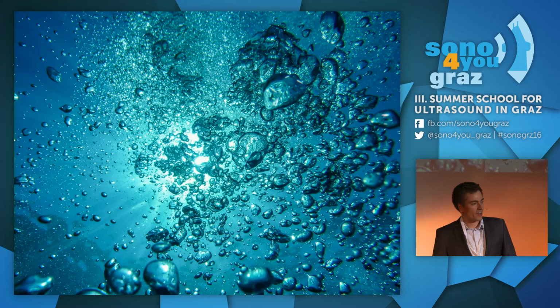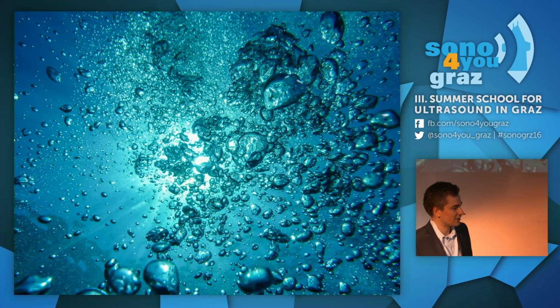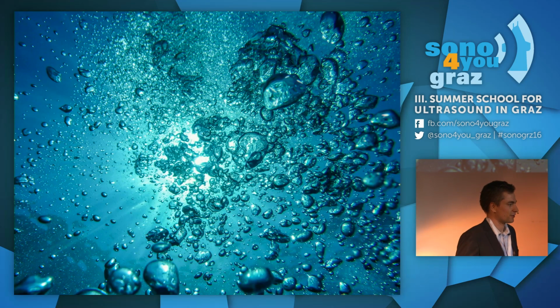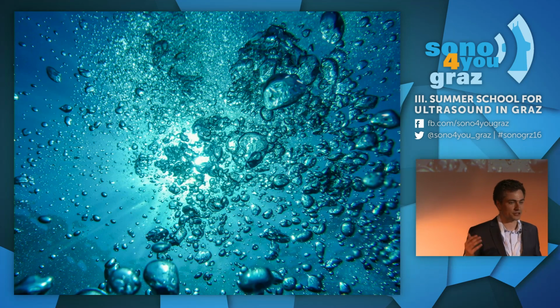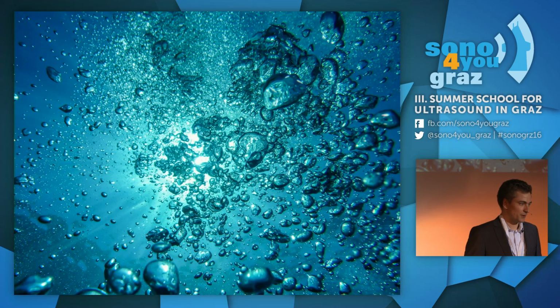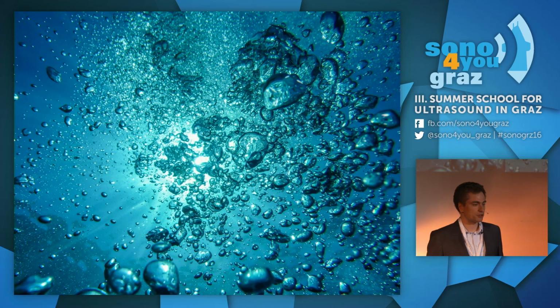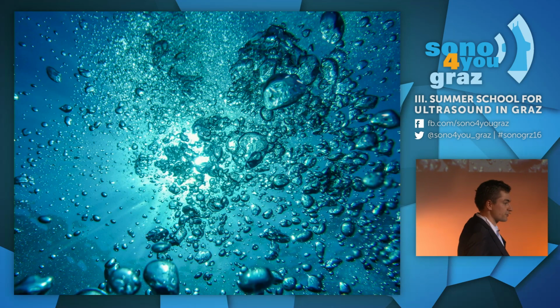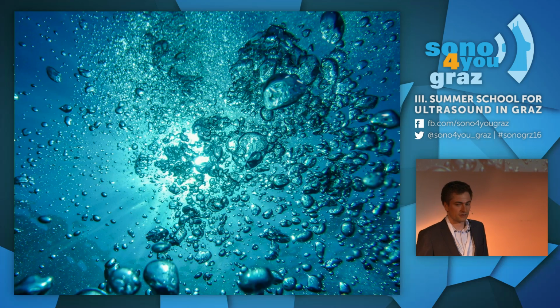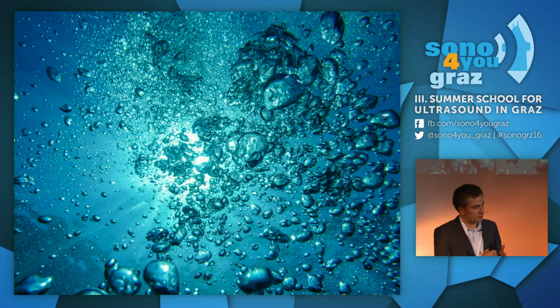I think you all had vacations, you jumped into a pool, you were swimming around, maybe snorkeling, and somebody jumped just in the pool. And maybe you remember the sound when somebody jumped into the pool. It was something different than when you would stand outside of the pool. And this is about conductivity of sound. And ultrasound imaging is nothing different than what you see there. It's sound waves traveling in water, traveling to cells, and you have all the interfaces, and the interfaces will do the image.